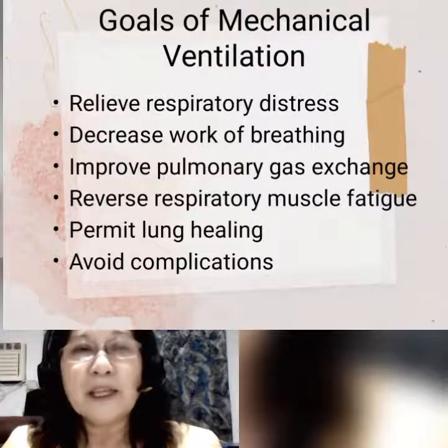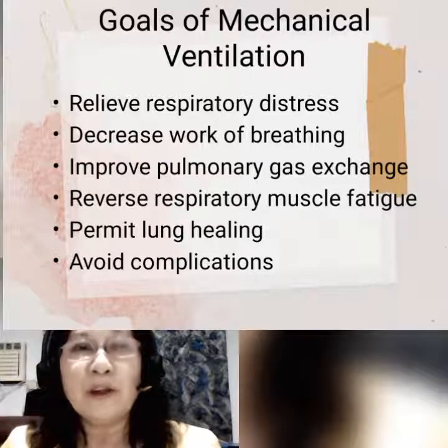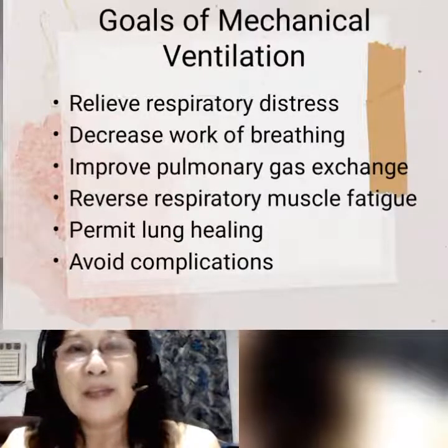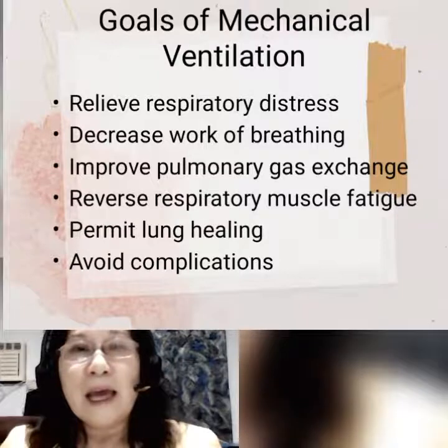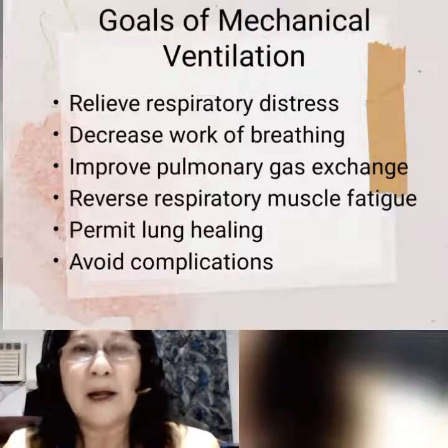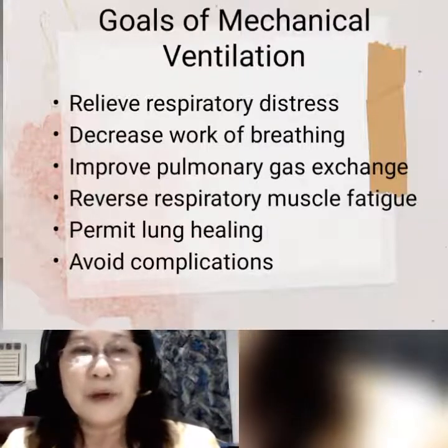Then, decrease work of breathing. If they have no energy to breathe on their own, they need to be ventilated in order to have a normal respiratory pattern. Another one is improved pulmonary gas exchange.